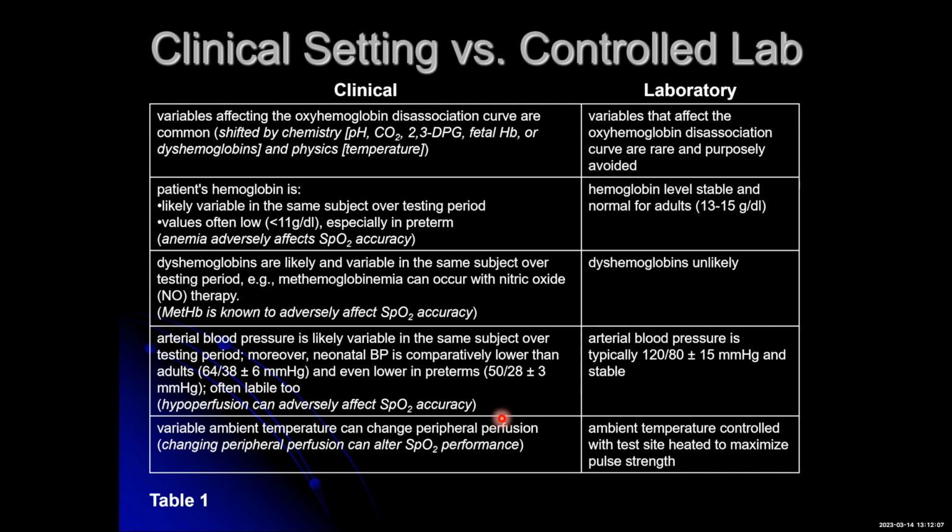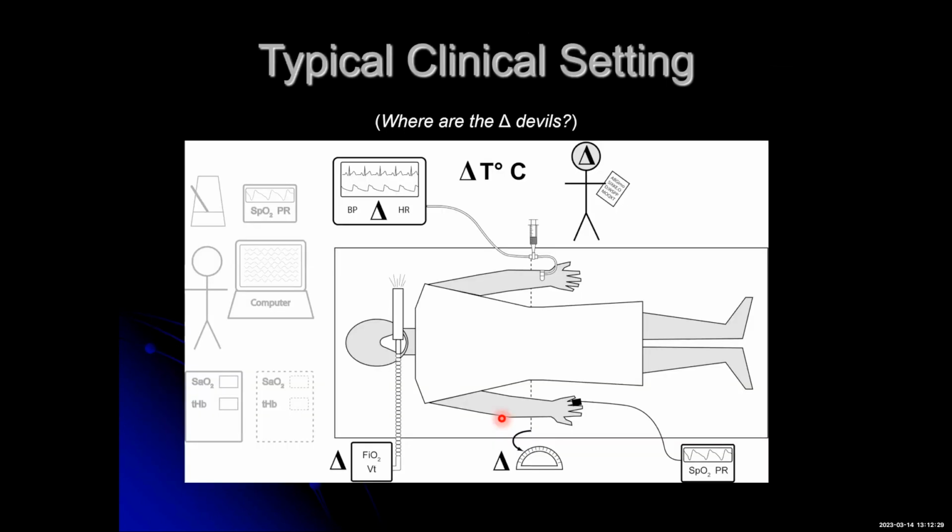Remember that if we're looking to reduce the signal that may be aberrant, that can come from lots of different sources. So even things like consistent lighting can affect the performance of these devices. So that environment needs to be well contained.